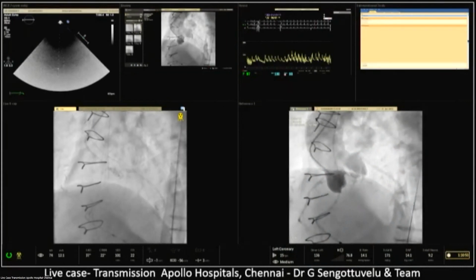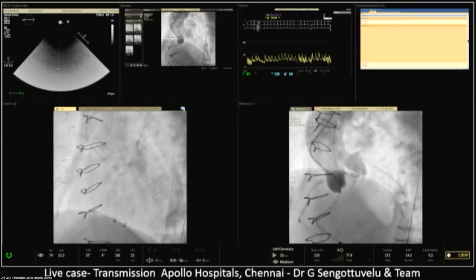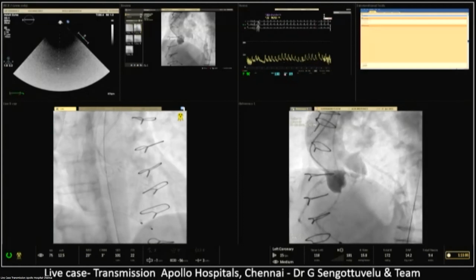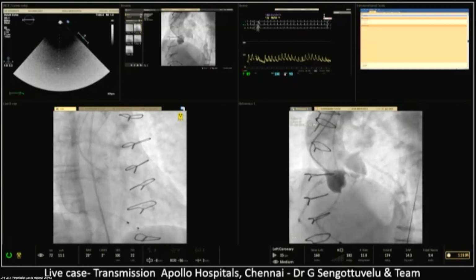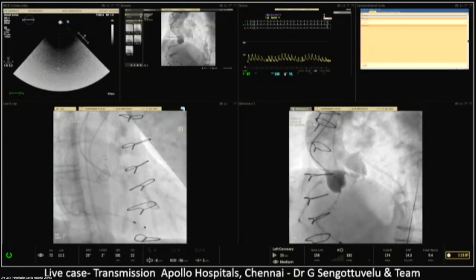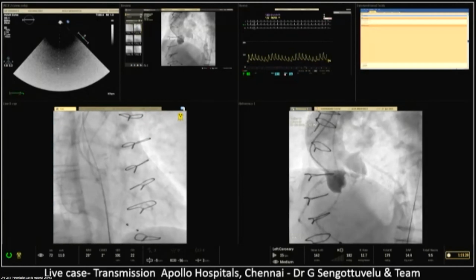I think the issue in the discussion is the risk of injury, right? We'll put the wire in and it won't turn this side. And every once in a while, especially in bicuspids, you do a balloon and the leaflet doesn't come back down. You end up with severe AR. And that changes the dynamic and the flow. Everything is rushed, and that's when other mistakes can occur.